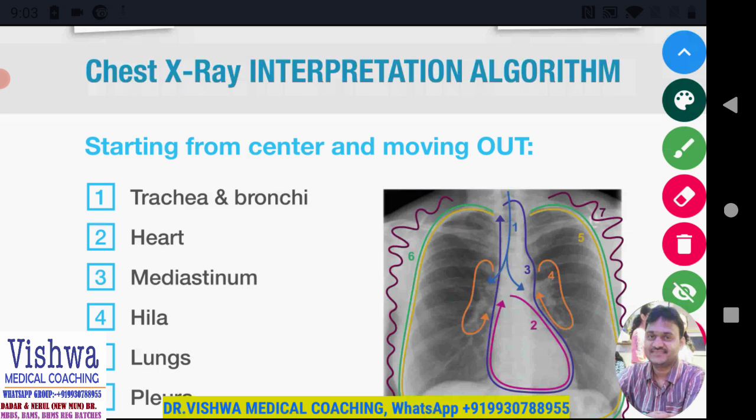This particular series will be maybe 2 or 3 lectures, which will cover the step-by-step approach to interpreting a chest X-ray. We are not going to cover any specific X-rays, but when you look at an X-ray, how exactly are we supposed to interpret it, and what are the things you should look at, so that we do not miss anything.